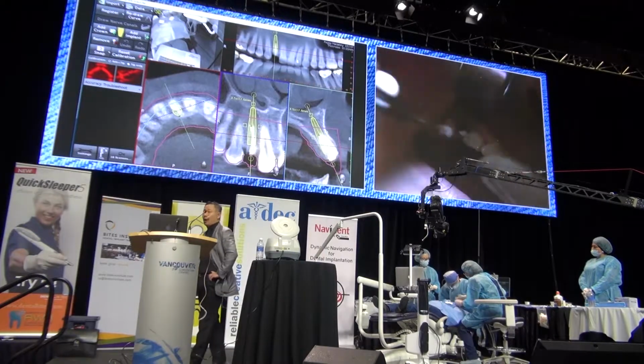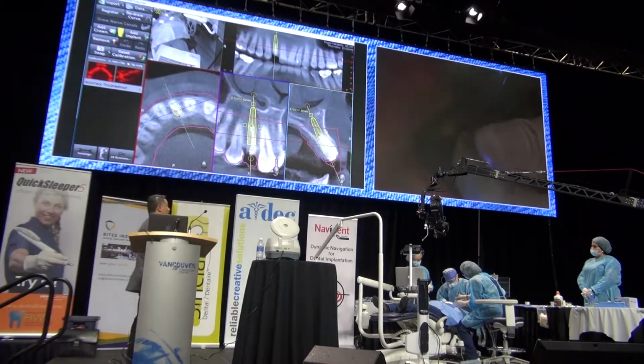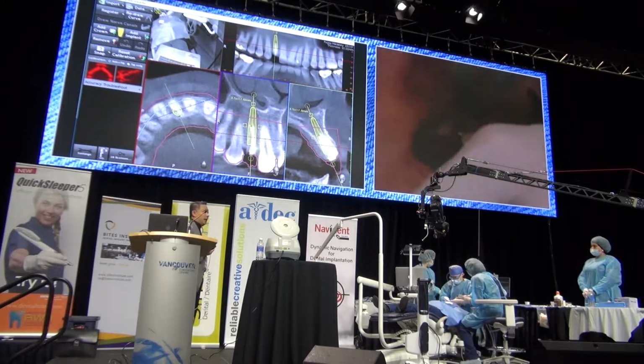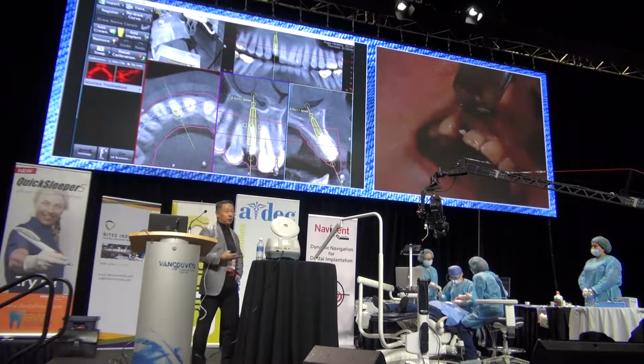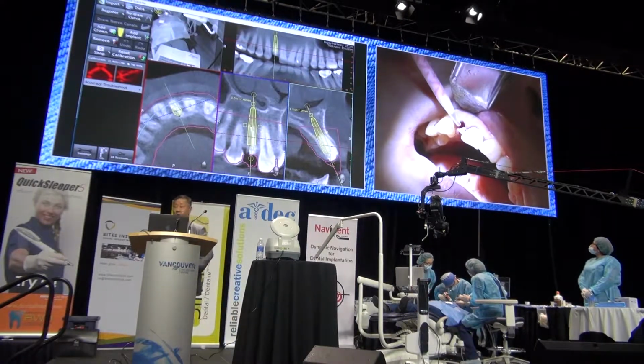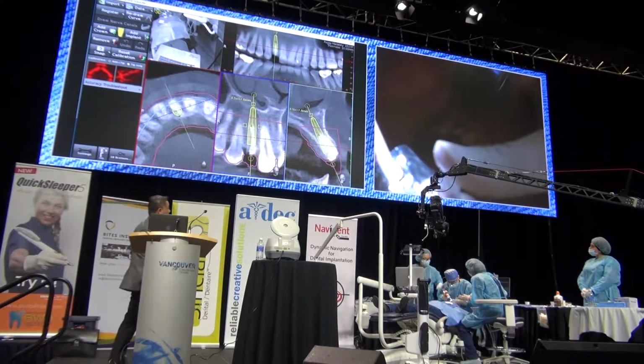A cement protocol is not predictable, and of course usually when the patient's on vacation, the cement comes out, they curse your name and so on and so forth, and the day you want to take it out, you can't get it out, you break the provisional. Trust me, been there, done that. So for all our provisionals, it will be screw retained by design.